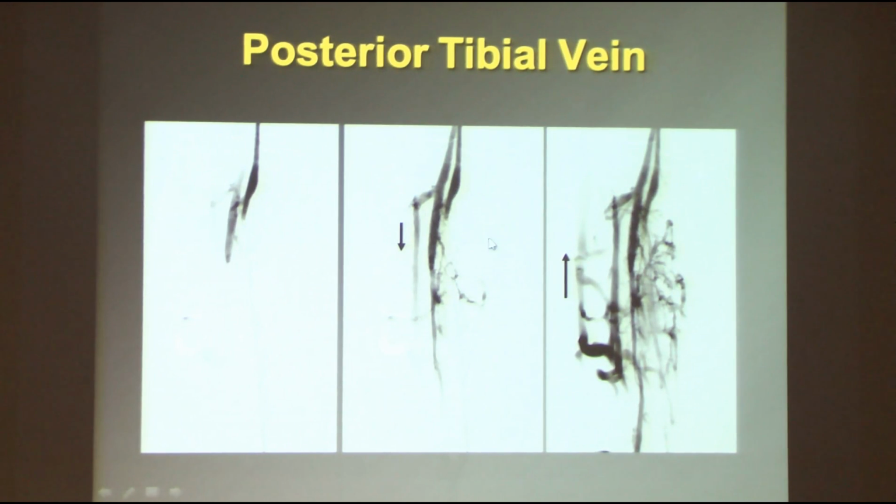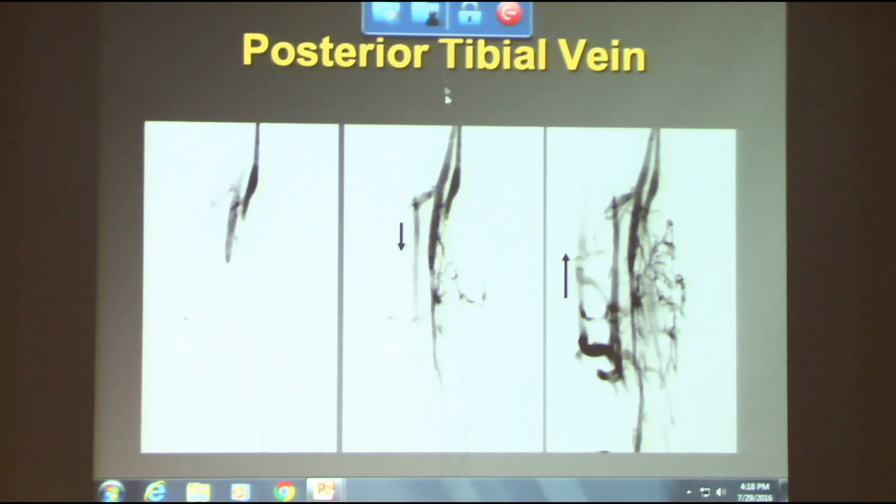And the reason I like to show these is they show how some of these dysfunctional channels affect the circulation. When we put a catheter in the deep vein here, it goes up one deep vein. Instead of continuing up to the heart, the contrast comes back down the other deep vein, so it's going backwards in the calf, and then through these perforators into the marginal vein.